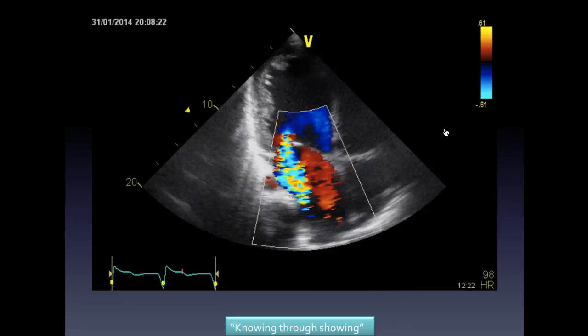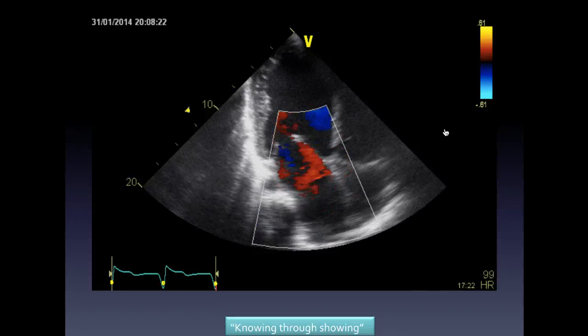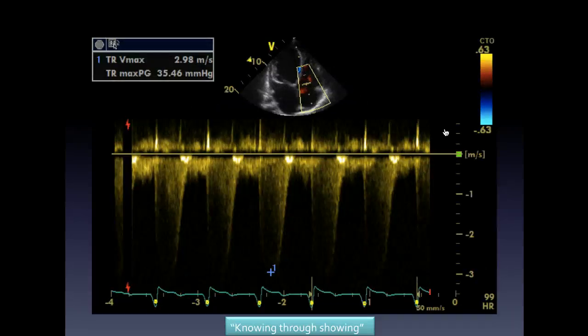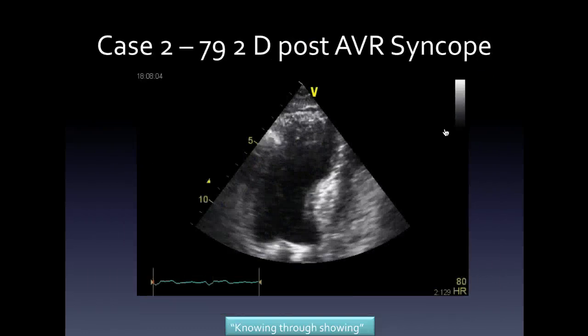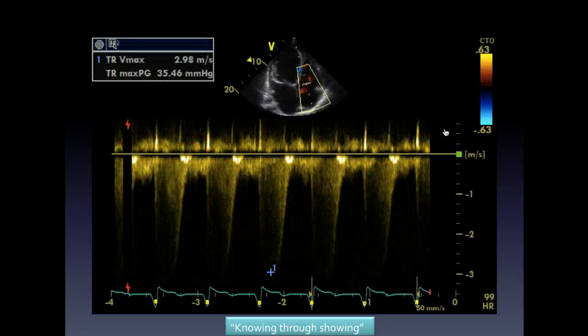Okay, so in measuring his left atrial pressure, we missed the boat on him because we actually swanned him, and that's a whole other talk. Because to be honest, the Swan-Ganz catheter, the right heart cath, is profoundly important in the ill patient. I would argue in a whole other day. And while you can play around with echo and get estimates, which are very valid in the well patient, in the ill patient, unless you're really meticulous, you can either underestimate or overestimate intracardiac pressures.